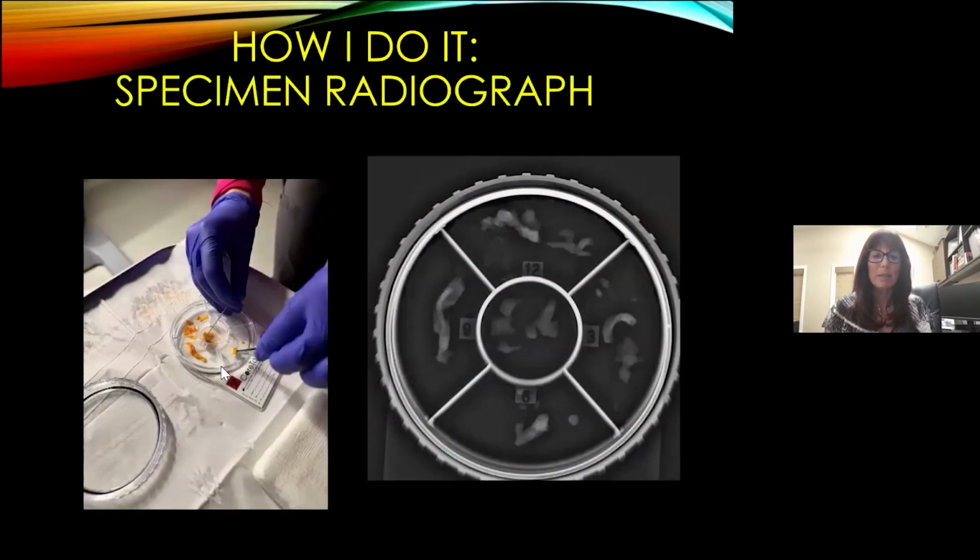We divide our specimens into the core biopsy tray. We can see on our specimen radiograph that we have representative calcifications here. The reason that we use this tray is our pathologists like to separate the cores with calcifications from those without. They do look at everything under the microscope.